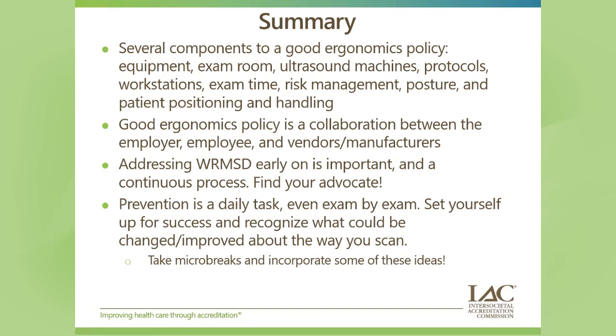Workstations, are they set up right for ourselves, for our readers, ensuring that not only when we're in front of a patient, but that we're considering how we're set up for that non-patient contact time, looking at the time that we're allotted for our exams, ensuring that we know what risk management is in our institution, how we get in touch with them, where we report things, examining ourselves with our posture and our patient positioning and handling.